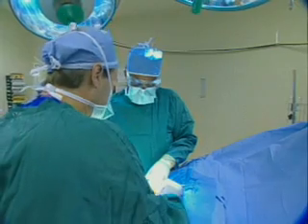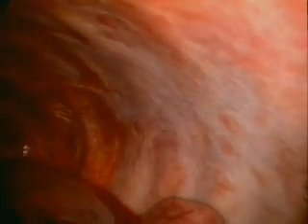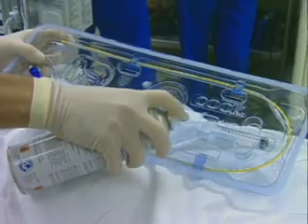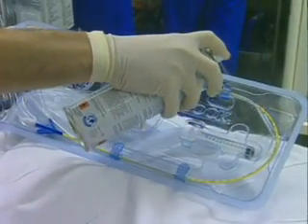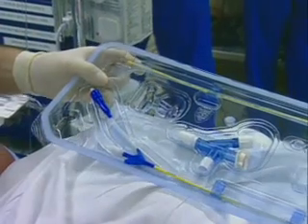In terms of the quality of surgical exposure using a bronchial blocker, our surgeons are similarly happy with the field exposure experienced with the use of a double lumen tube as they are with the endobronchial blocker. The placement of the blocker does require adequate lubrication, and the lubricant of choice in this situation is an aerosolized silicone spray.